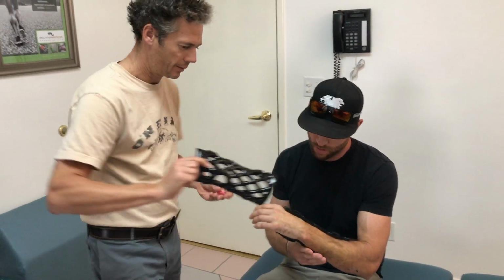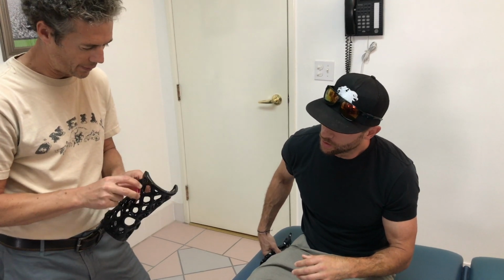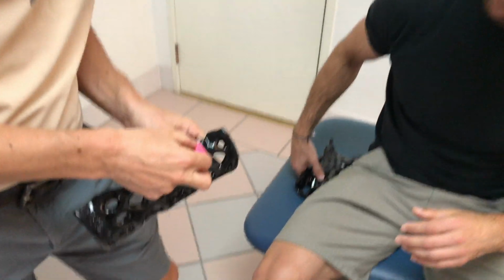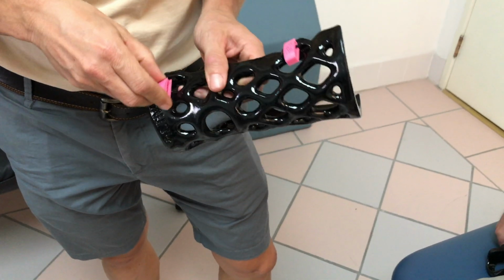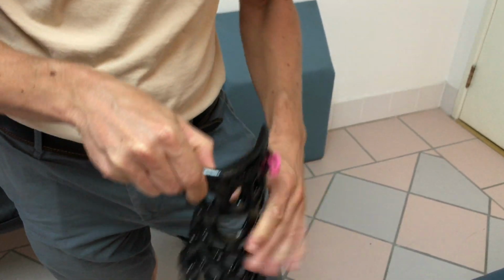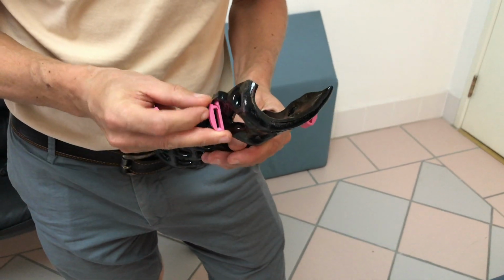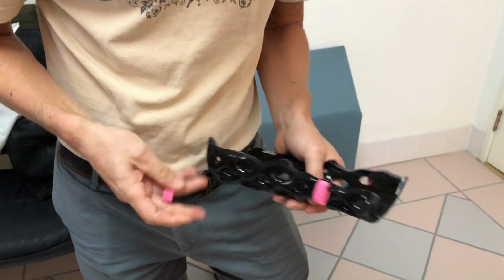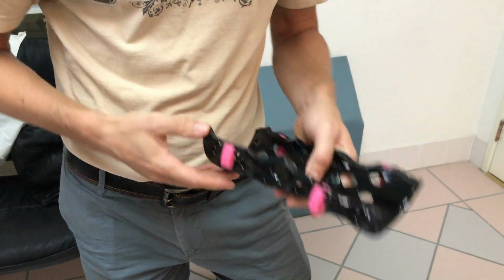These are what we call J clips. We've talked about these a little bit. So when I get these put on sort of halfway, there's a little catch right here, so they stay in that position when they're not in use. First few times putting it on and off is a little bit of a learning curve. Well, hopefully I'll just leave it on, like a good boy. You might take it off though occasionally. You never know.